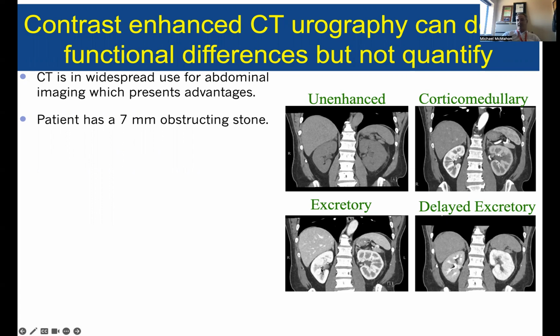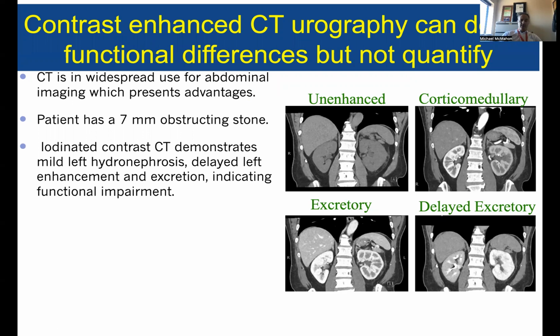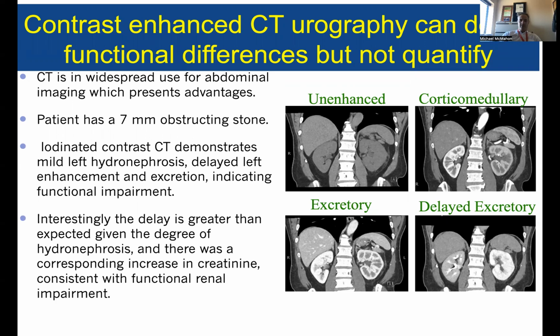kidney on the left side, which is actually the right kidney, is very fully highlighted, whereas this is still in the medullary phase for the right kidney in this image, but left actual kidney. And then in this delayed excretory phase, you can see that this left kidney here has cleared the agent, whereas this right kidney has not. And so this is showing that, in fact, there's a functional impairment for the one kidney compared to the other.